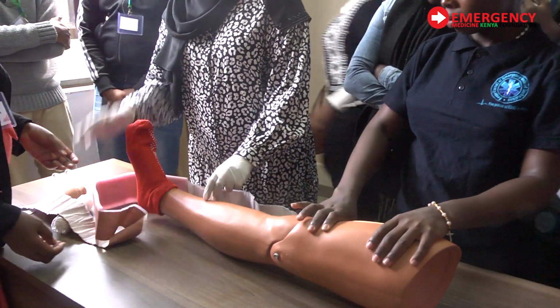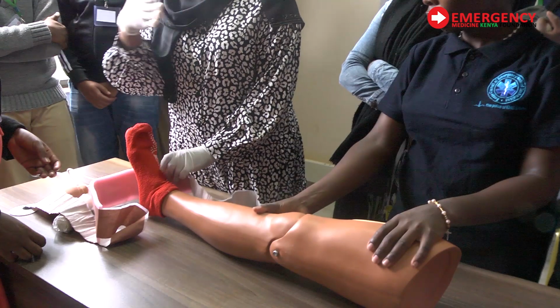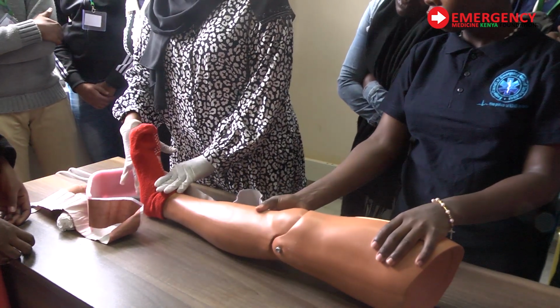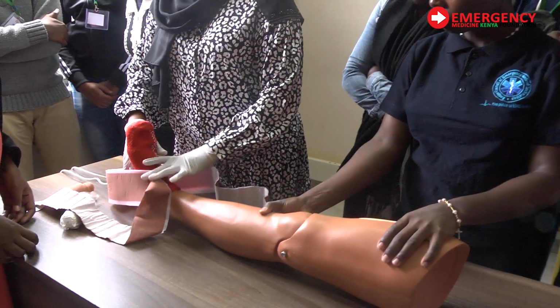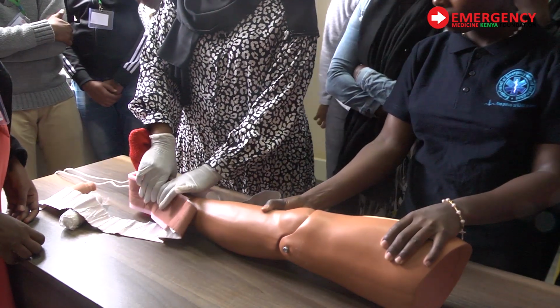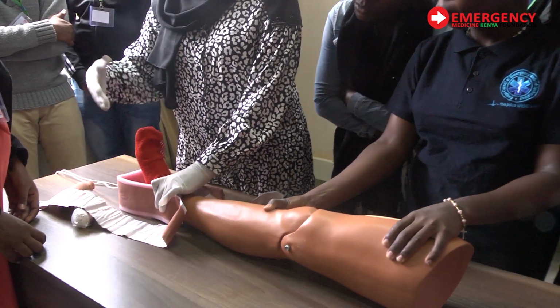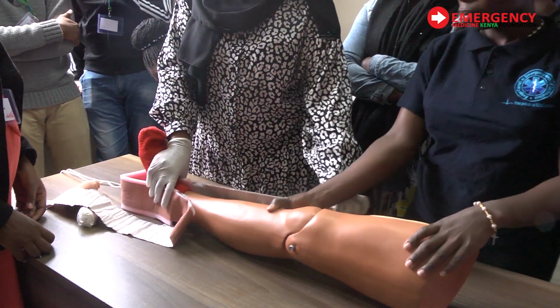So most of the time what I do, they say for 10 centimeters, me I normally use my fingers, okay? Like 4 fingers, okay, should be a space from there. This way it gives a good proper traction because you need space. So I do this then make sure at the malleolus it's well covered, okay? So 4 finger breadths or whatever centimeter you want to use, okay? Then just hold here.